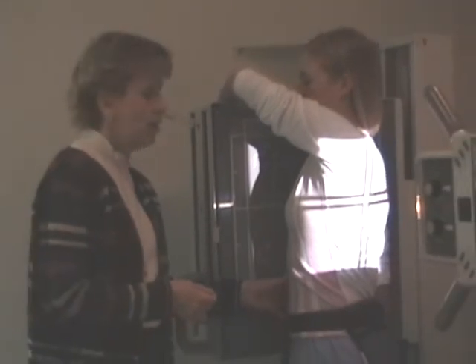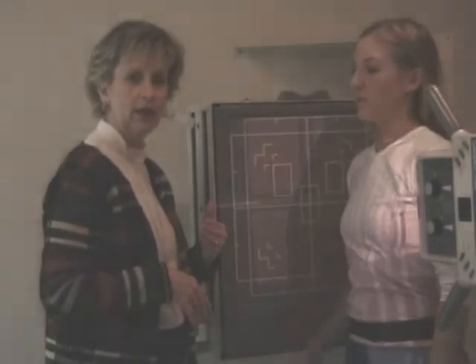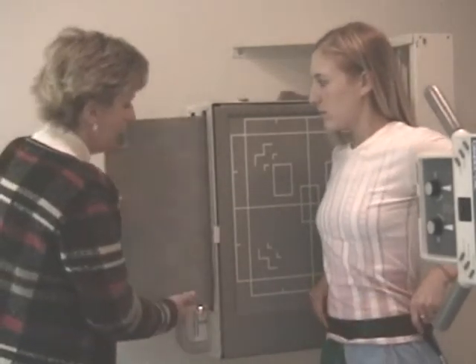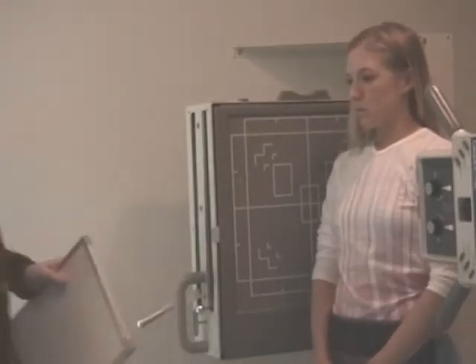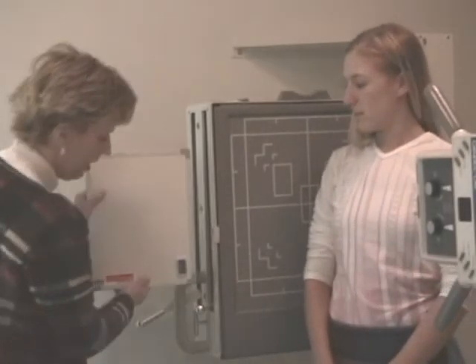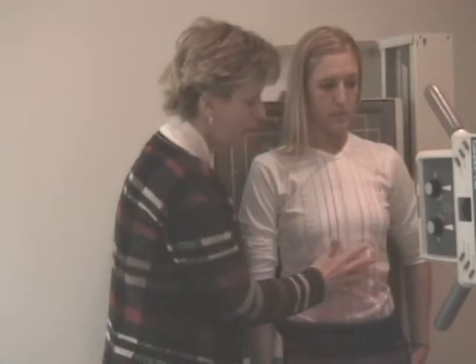She can relax. For the below diaphragm ribs, I would have to change my technical exposure factors because I'm over the abdomen. And again, many techs will just take the 10 by 12 and put the patient's back to the board, and I'm after the left side because her ribs don't come around to the front.